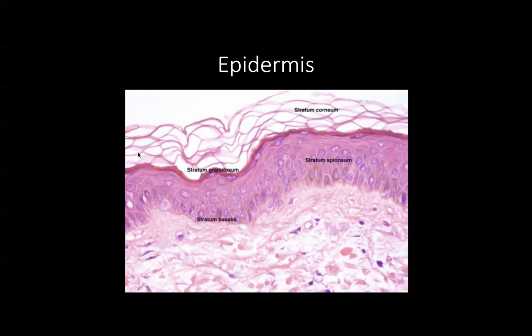This is where you'll get hyperorthokeratosis, where you've got a lot of this anucleate stratum corneum. It can be compact, or it could be basket weave like this. This is orthokeratosis. And then you can also have parakeratosis, where you have retention of the keratinocyte nuclei, and that usually suggests some type of faster cell division is happening. Oftentimes when you have parakeratosis, which you do not see here, you'll have an underlying hypogranulosis underneath that. That'll become important in a lot of different entities that we will discuss.